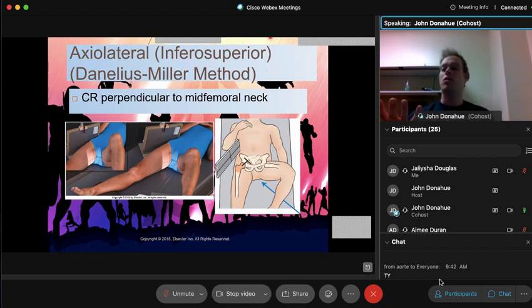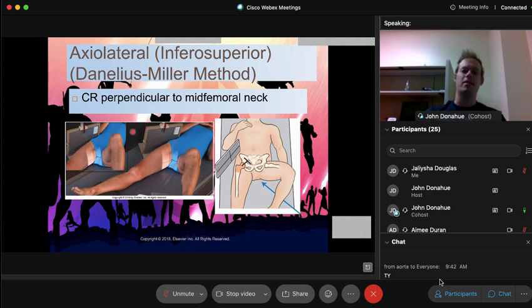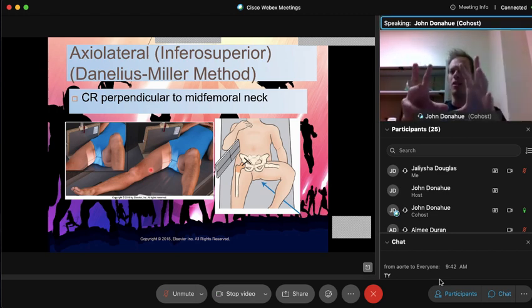So what are we going to do? Of course, it is going to be tabletop. Now, you will see on this picture, they have just a free cassette. I don't recommend doing this. I do recommend, if you're going to do a Danelius-Miller, guys, that you utilize a grid. Because once again, the hip is very thick. You're penetrating a very thick area. You need that grid to clean up that image to increase that image quality. Very, very vital. Or it's going to be very, very washed out. The contrast resolution is going to be very low. It's going to be a very white image. It's not going to look good. So make sure you use that grid.